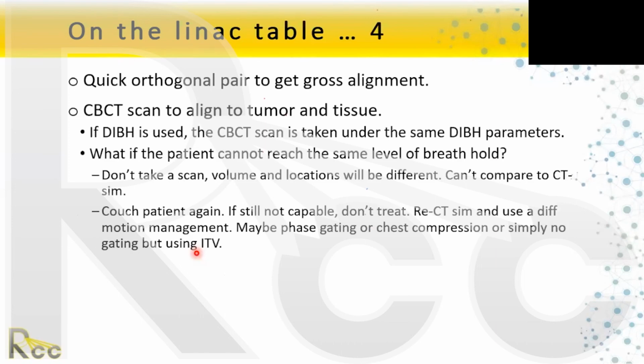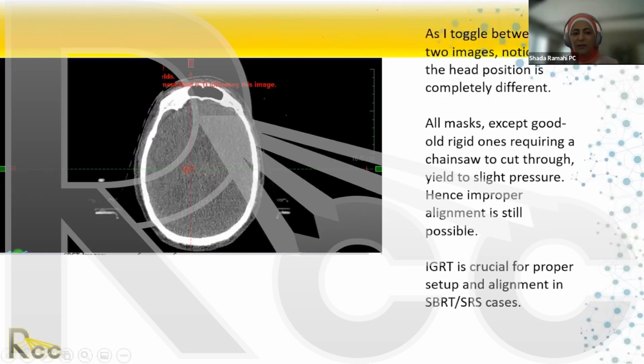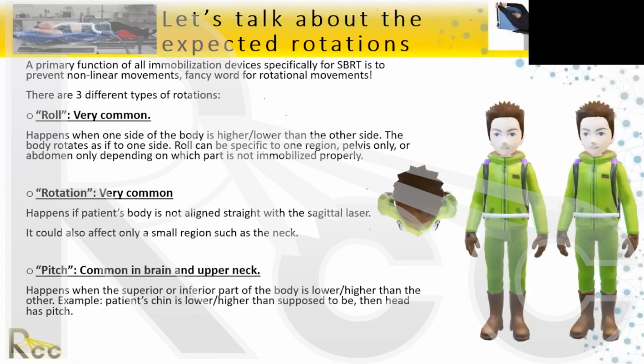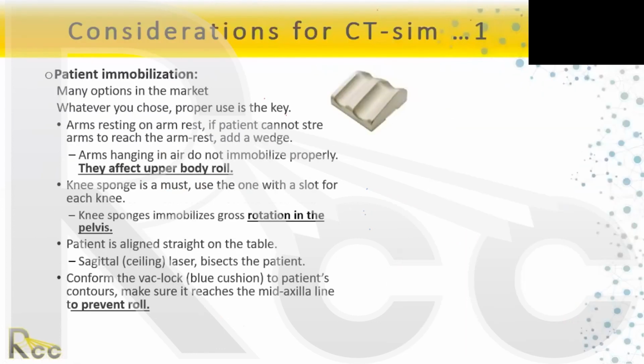For claustrophobic patients, we use open masks. Yes, you can do that. Precision is enough. Is what is enough, sorry? A question: what's your take on using an open face mask and a precise mouth bite for a claustrophobic patient? Is it acceptable?